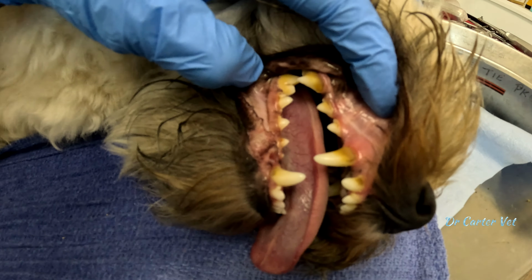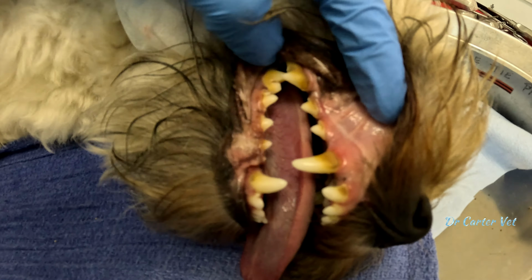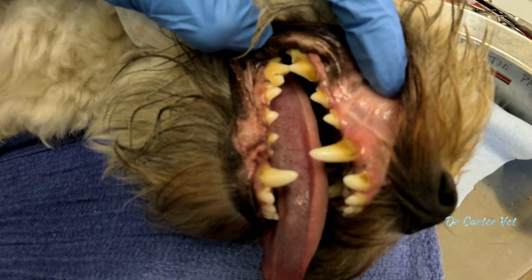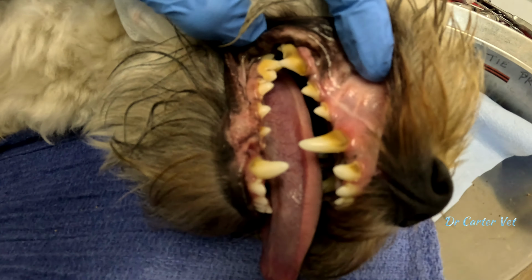Yep, so you can see significant dental tartar buildup here. I'm going to start cleaning this side. Maybe we'll get some footage. I'm also going to show you the tools that I'm using.